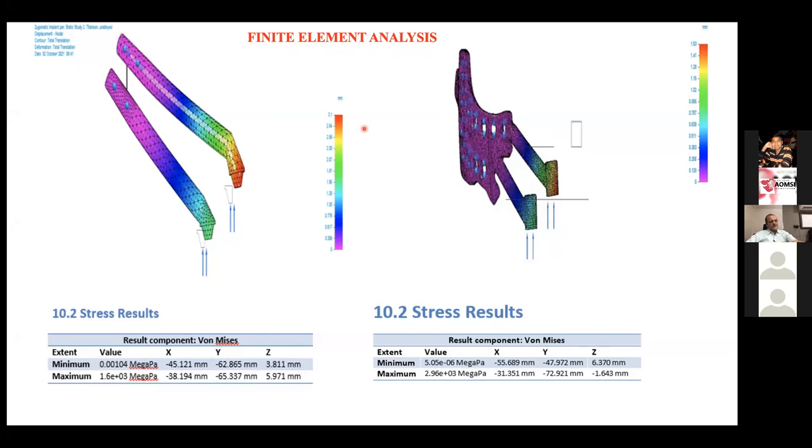So now you have to convince the patient that this is like a prosthetic. If you cut your leg and put on a prosthetic, you cannot run with that leg. Same way, when we are prosthetically rehabilitating you, you cannot break an almond with your prosthetic teeth. It is for normal function, normal chewing, normal eating. You can have a normal diet, but if you give eccentric movement, any implant is going to fail.